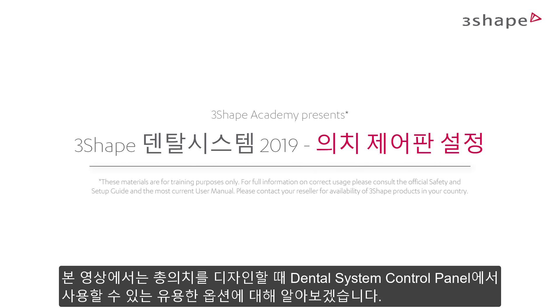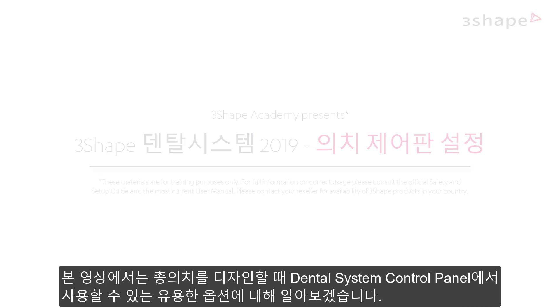In this video, we will show you some useful options for full denture features, which you can find in the Dental System Control Panel.